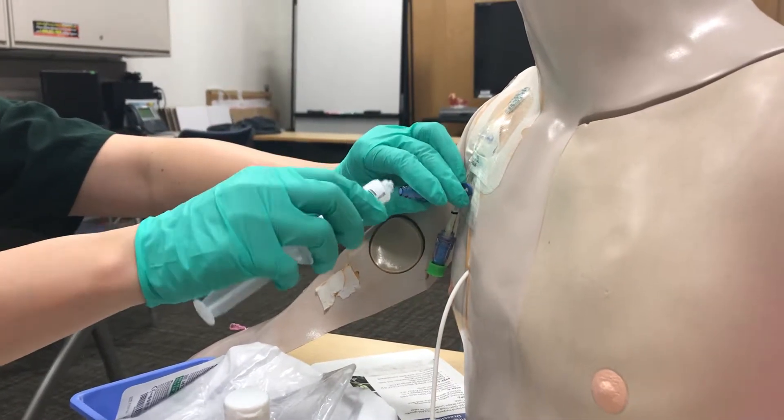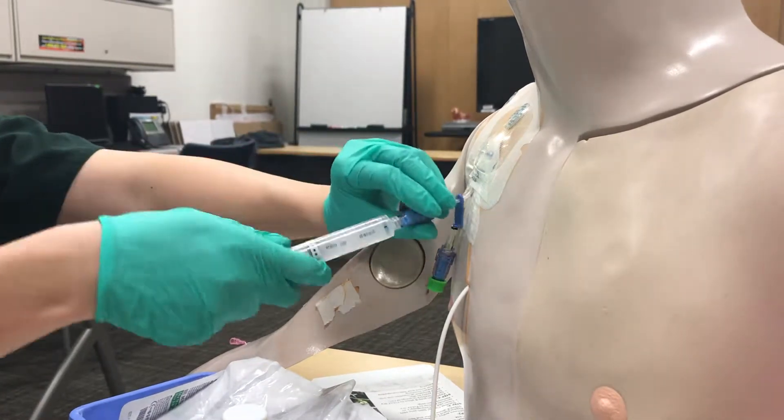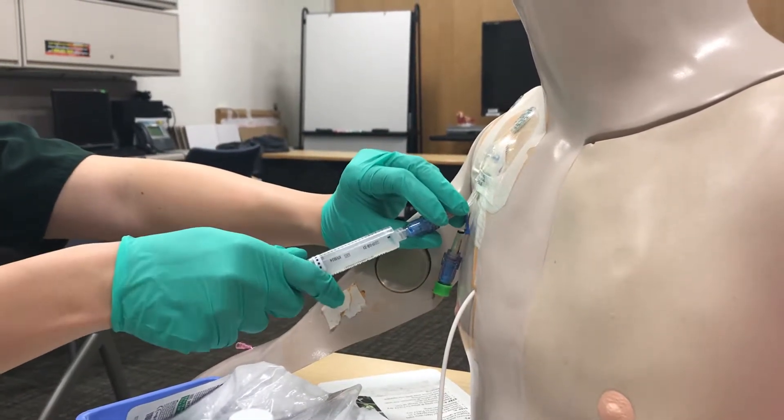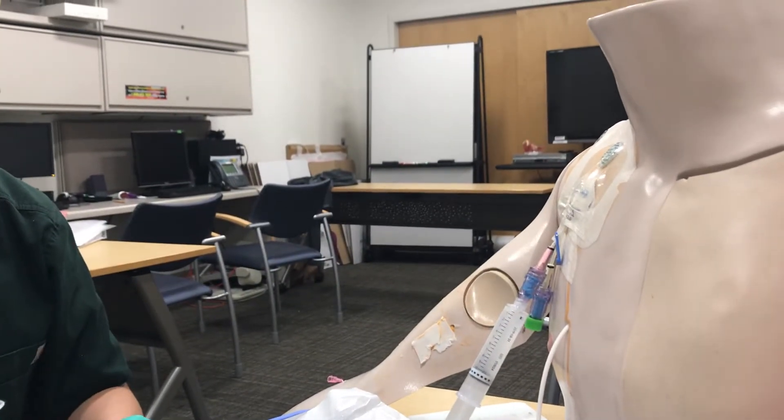Open the new cap, clamp the line, attach the cap, and go ahead and give a good 20 cc's of flush. And that is how you do blood cultures for both a central line and a peripheral stick.